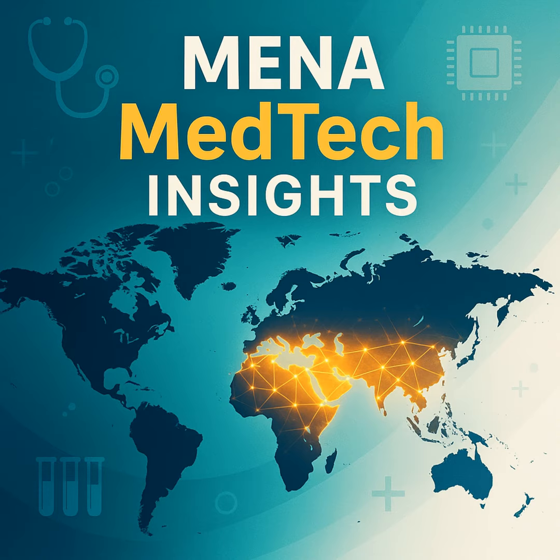The SFDA's framework is modern, risk-based, and harmonized with global standards from the International Medical Device Regulators Forum. It classifies SaMD into 4 categories based on the risk they pose to patients and public health. Class A represents the lowest risk, while Class D represents the highest. The core principle driving classification is not the software's complexity, but its intended use. Let's look at some practical examples.